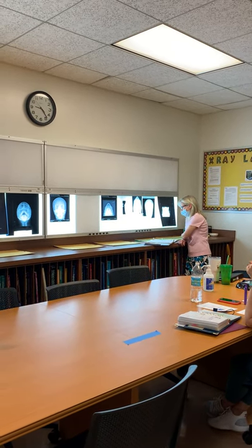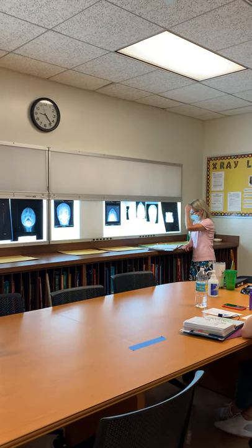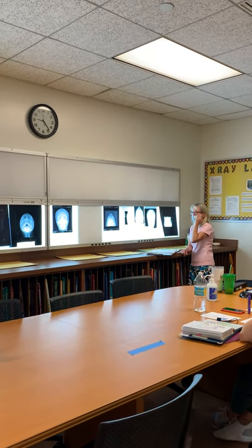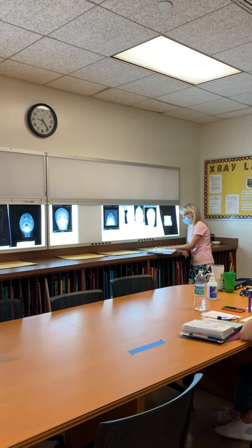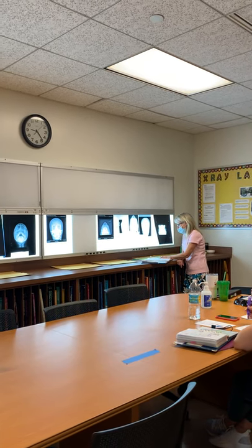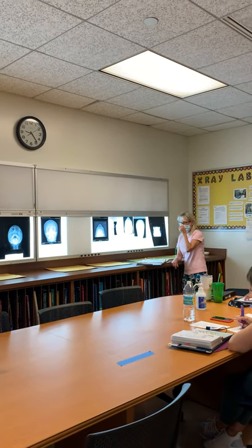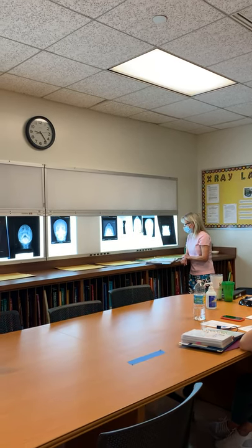Okay, tangential projection. This is for people that you just can't see the zygomatic arch. Sometimes you can't. They have really little cheekbones, really depressed cheekbones. So under the quality checks, this projection is especially good for patients with depressed fractures or flat cheekbones. We do this.